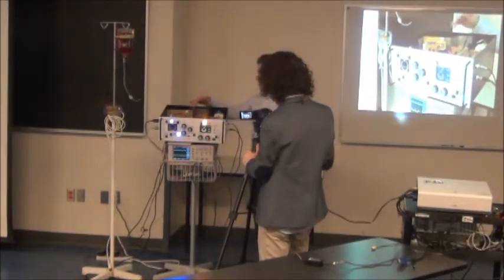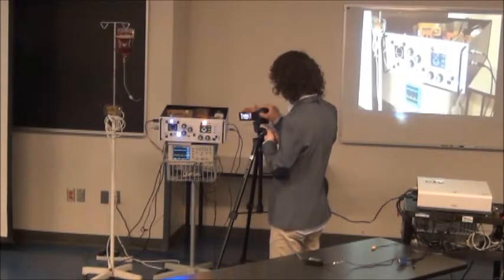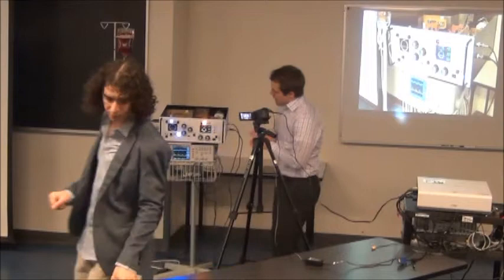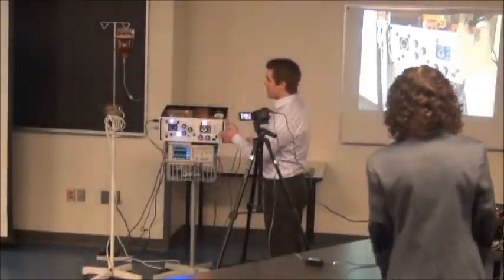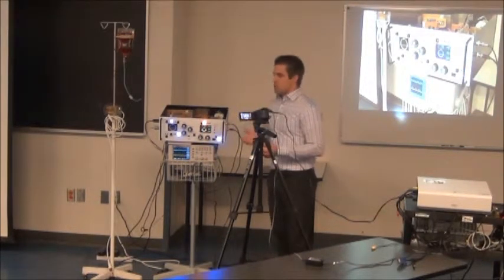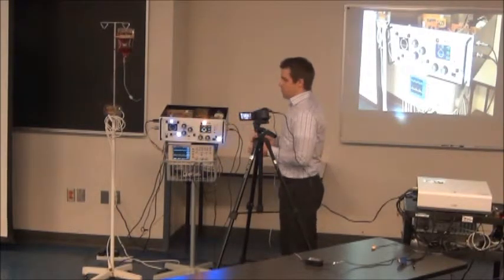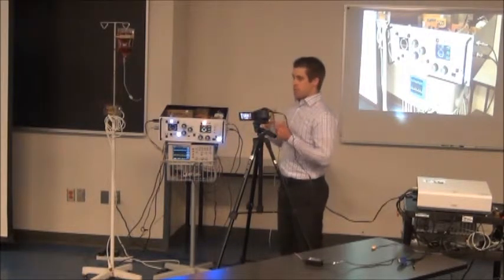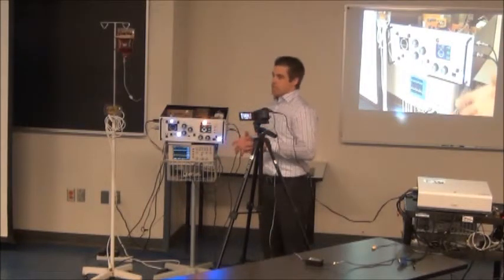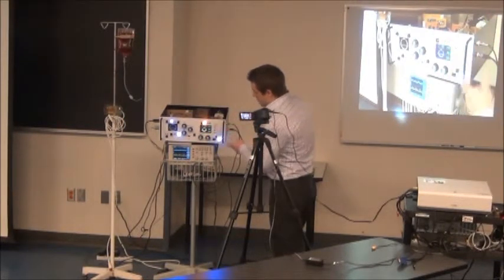We also have our 22 gauge galvanized steel EMI protection at the back, which prevents noise from the transformer and the inlet connector. We also have our resistive touch LCD, which will be explained in the other upgrade section because it is a much larger upgrade. What this allows for is a lot less space taken up than the other output screens that we were given to use. Those screens would have taken up about this size if you compact them all together. This one's much smaller, as you can see.